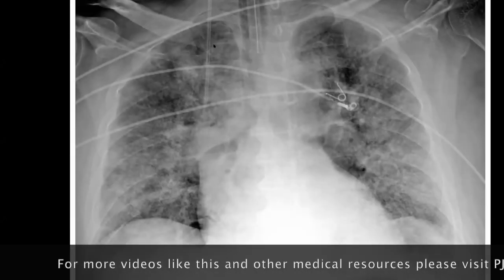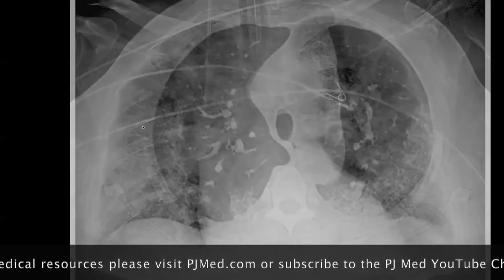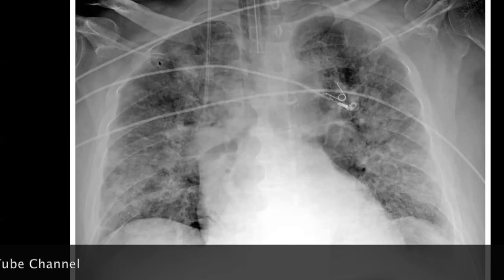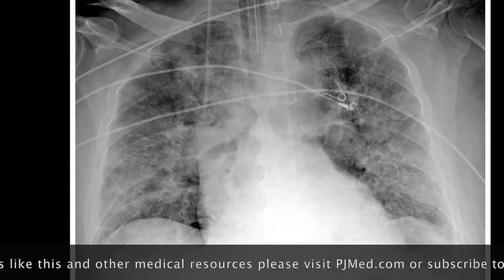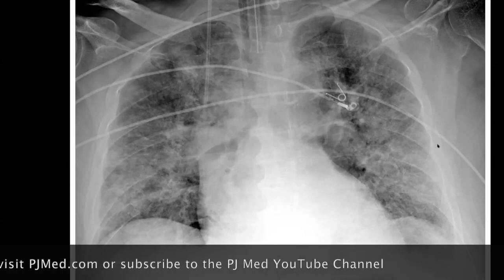We wind up with a chest x-ray like this. Just chest x-ray review 101. Black is good. White's bad in the lungs. We want to see some lung tissue that looks normal, unless it's a pneumothorax. This is a patient in fairly late stage COVID-19 disease with profound acute respiratory distress syndrome, okay? Lots of fluid and inflammation is causing this horrible picture that you see here, okay?